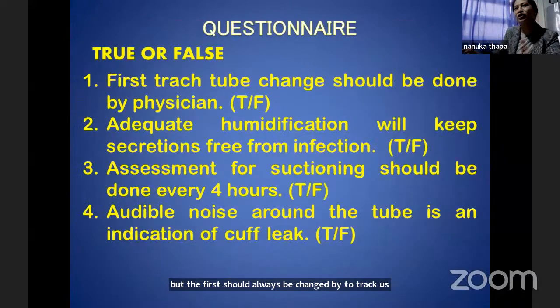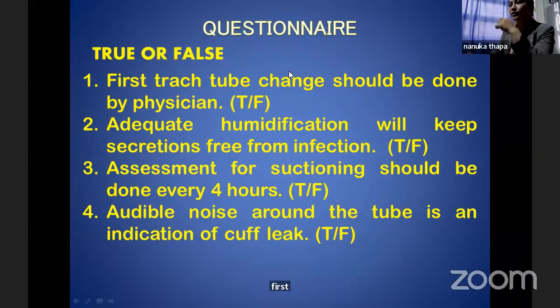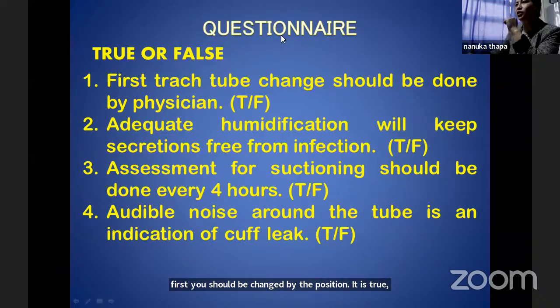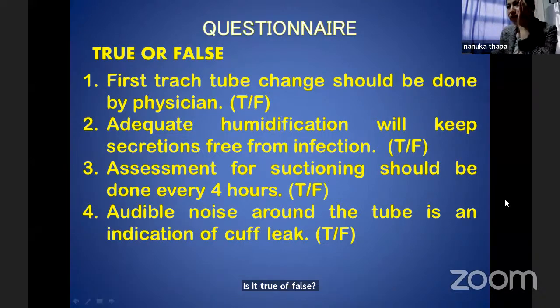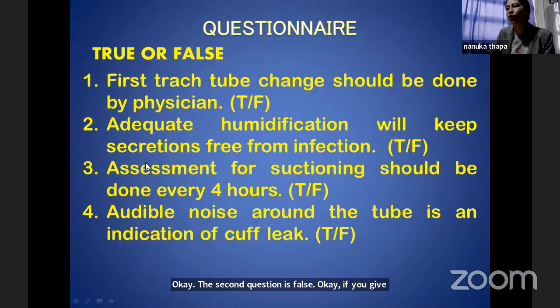So, the first question: the first trach tube should be changed by the physician. It is true. Then the second question: adequate humidification will keep secretion free from infection. True or false? Okay, the second question is false. If you give adequate humidification, it will keep the secretion thin.